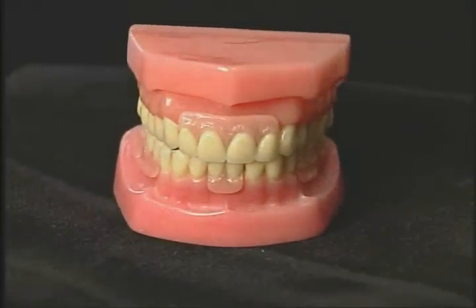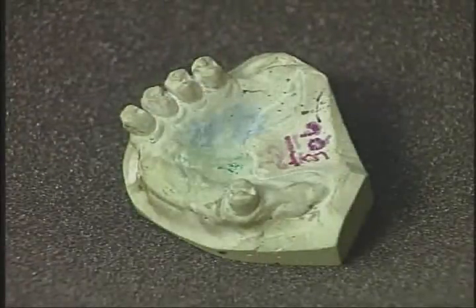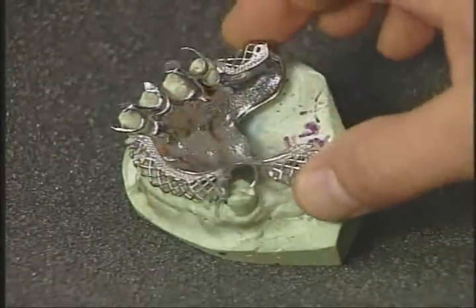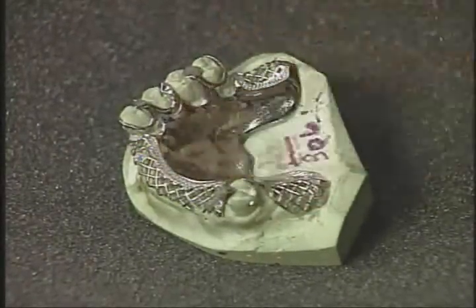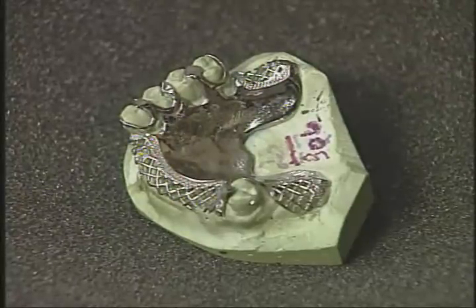The Equipoise design system for removable partial dentures was developed to meet the following demanding criteria. One, the prosthesis must protect, preserve, and strengthen the abutment teeth. A partial denture should not be a means to an end, but the end itself.